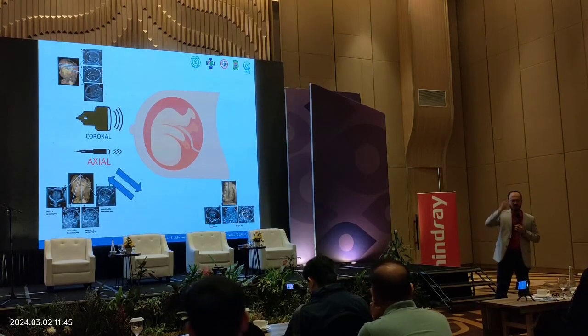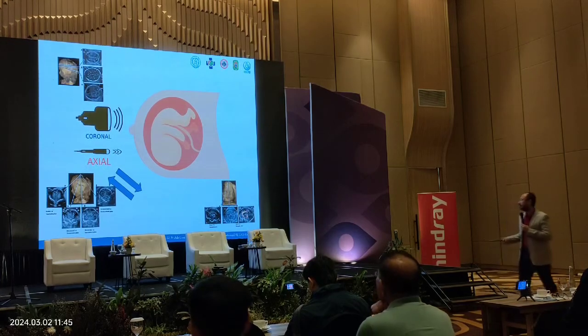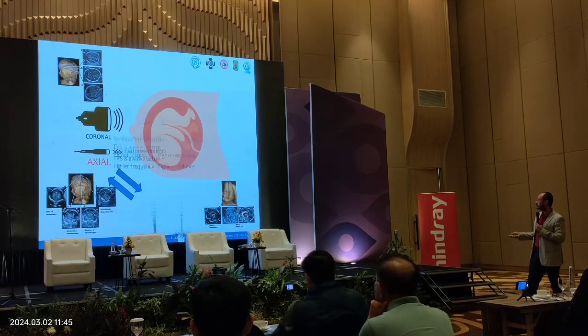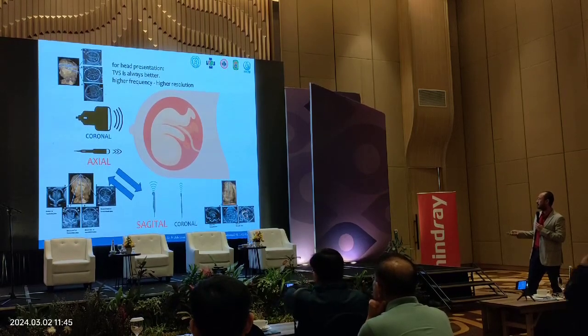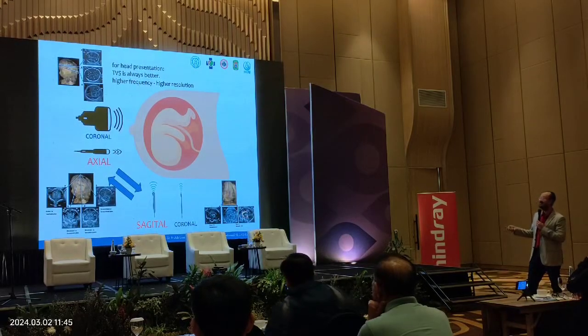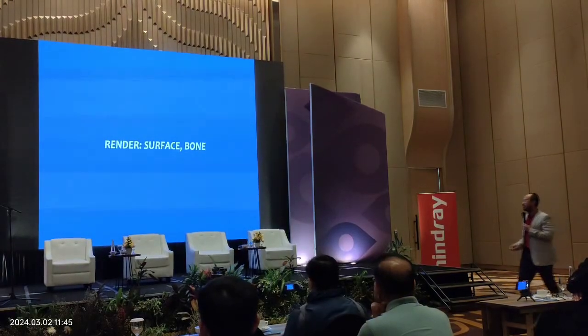If you want to do mid-sagittal, it's impossible, instead of doing transvaginal. If we are doing transvaginal, the axial becomes a direct sagittal in 2 dimensions.